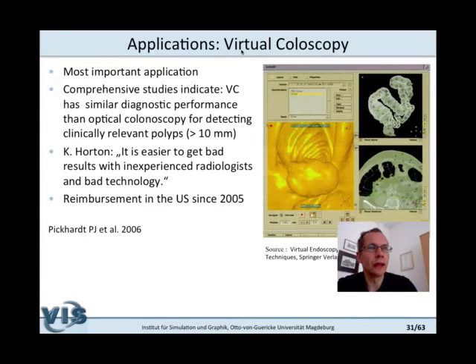So that's validation. Imagine for a moment that it turns out there are few artifacts and they are not so extended. So basically the results from virtual endoscopy are usable. Then the question is, of course, are they also useful? Do they provide additional information for a clinician? Do they provide clinically relevant information that may be useful for a therapy decision? So that is what is called the evaluation. The evaluation is more about the usefulness, and we will think about this also.